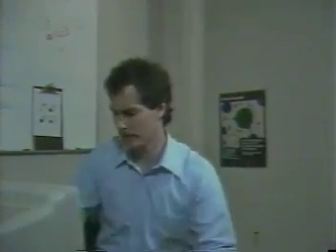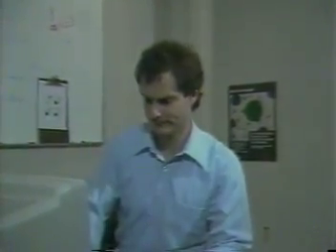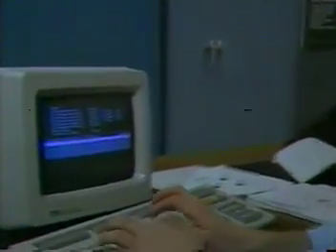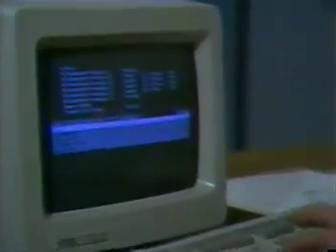Sure. Come on. Okay. As Ken took blood samples from the triplets, Tom entered a protocol for his triplet B-cell study into FACS Desk. Tom will enter a description of each cell and reagent in his study, then he'll mark which samples will receive each cell and/or reagent. Later, FACS Desk will use this protocol information to label and catalog the data it collects for his samples.